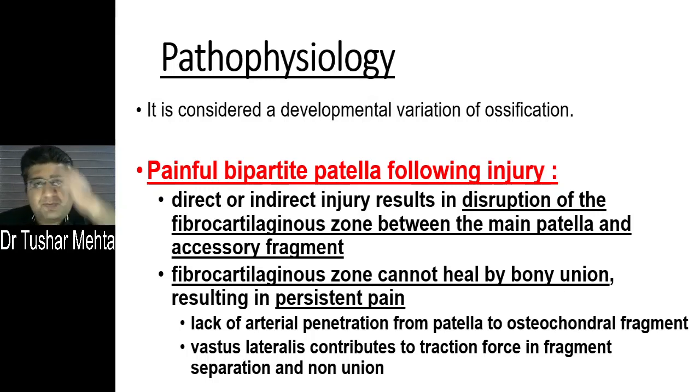So again, I'm repeating this for you because in this topic there is hardly anything. There are only three major things. Number one, it's a good radiology spotter. Number two, it can be confused with patella fractures. Don't worry, we are going to discuss that as well in due course of time.